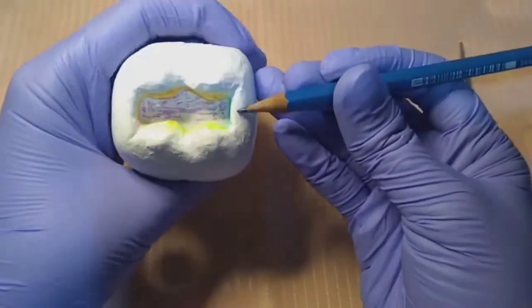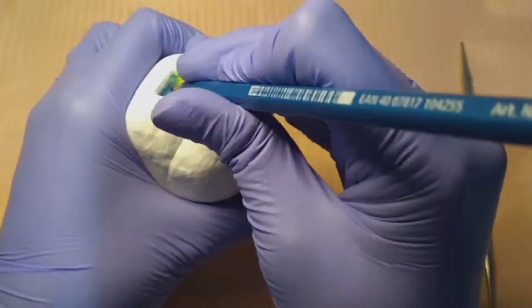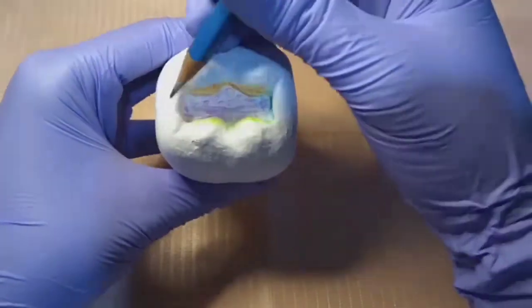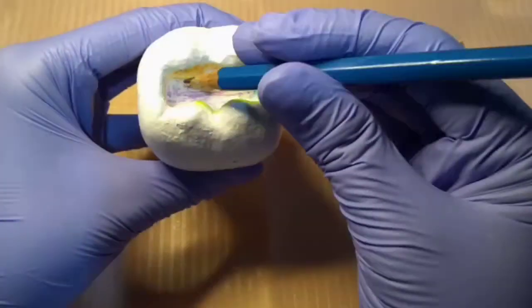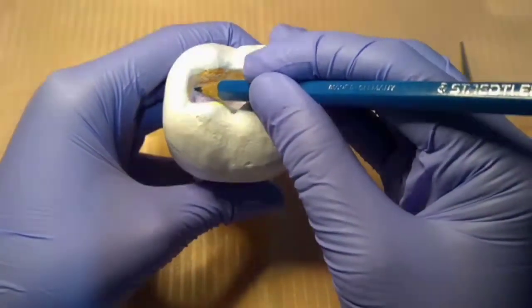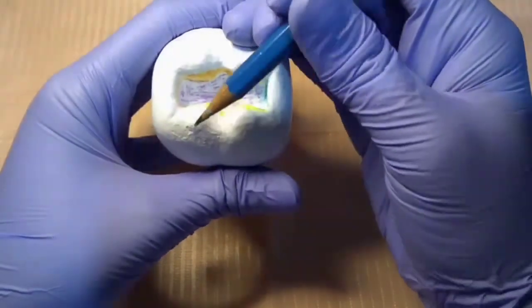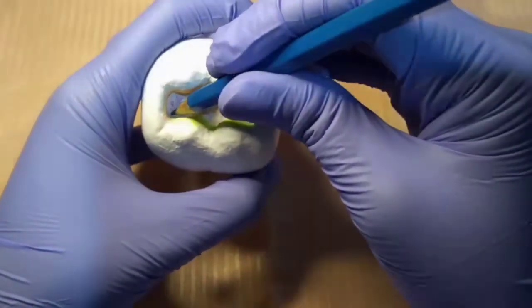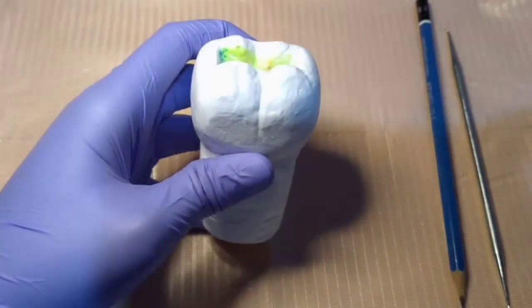Then, the distal wall, the lingual wall, and the pulpal wall, which form the disto-linguo-pulpal point angle. Then the next one is the mesial wall, the buccal wall, and the pulpal wall, which form the mesio-bucco-pulpal point angle. And the last one is the mesial wall and the lingual wall plus the pulpal wall, which result to mesio-linguo-pulpal point angle. And that is the explanation of my cavity preparation.